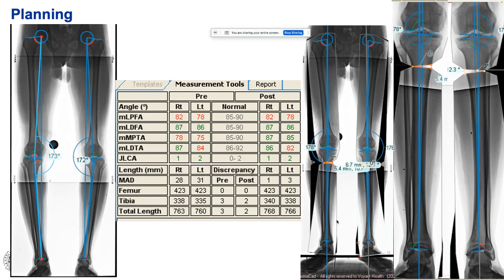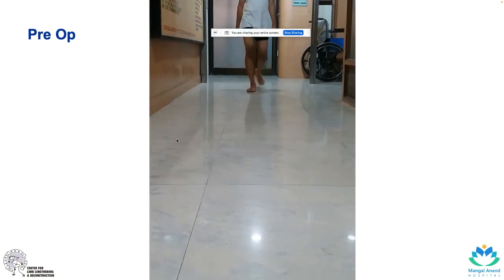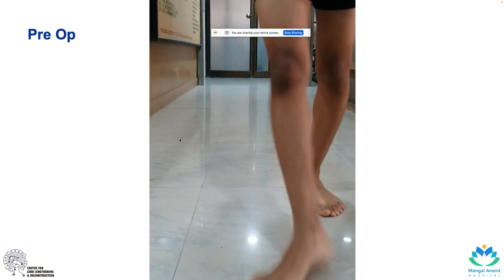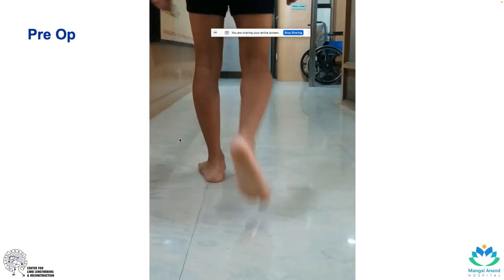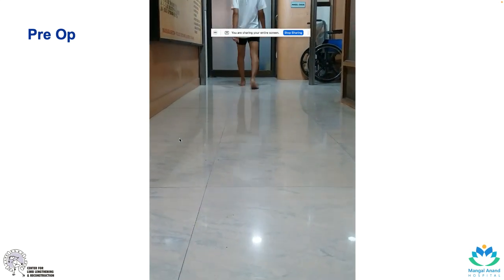We performed TraumaCad planning. It shows LDFA is normal, and the deformity is entirely in the proximal tibia on both sides. The CORA is found at the metaphyseal region. Doing an osteotomy there corrects the deformity well. There is no limb length discrepancy. Clinically: squinting patella, no thrust.